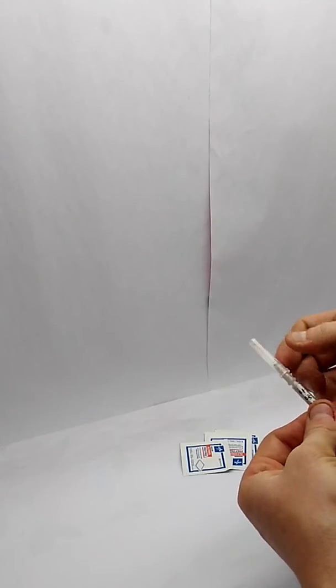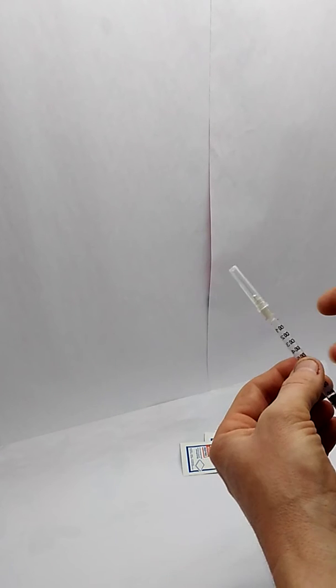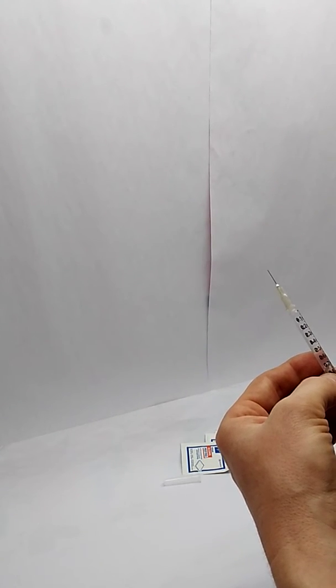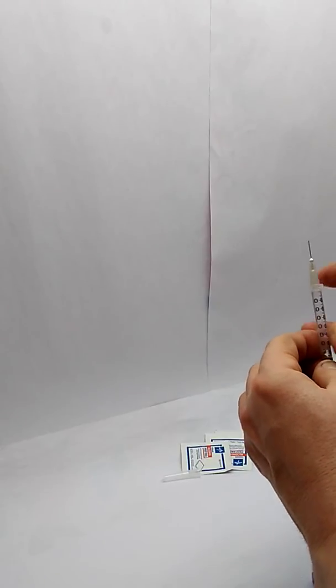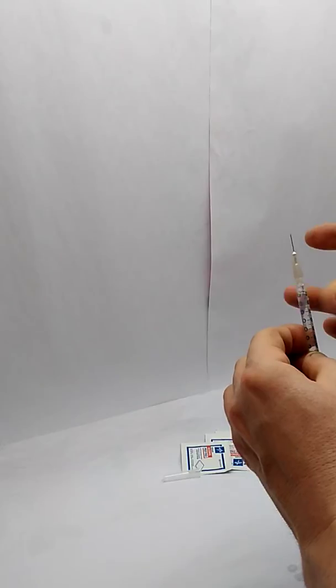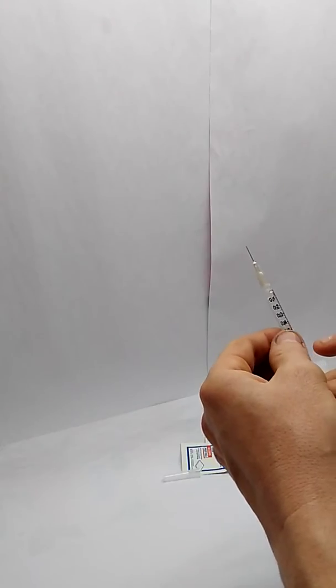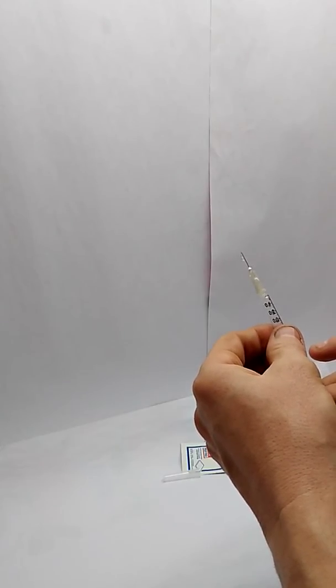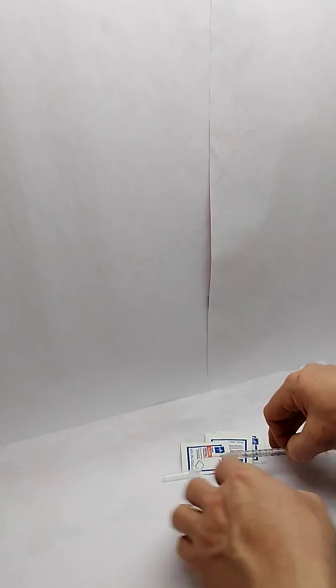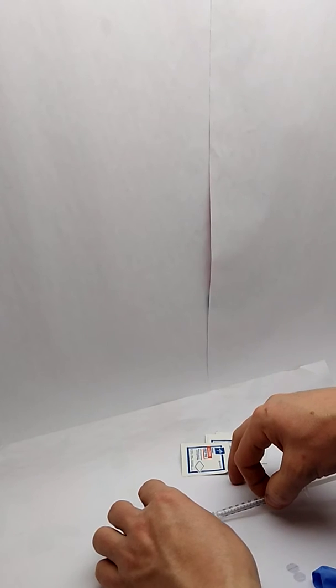I'm loosening that. I now have my 1 milliliter. I'm going to scoop cap that and set that on a clean surface.